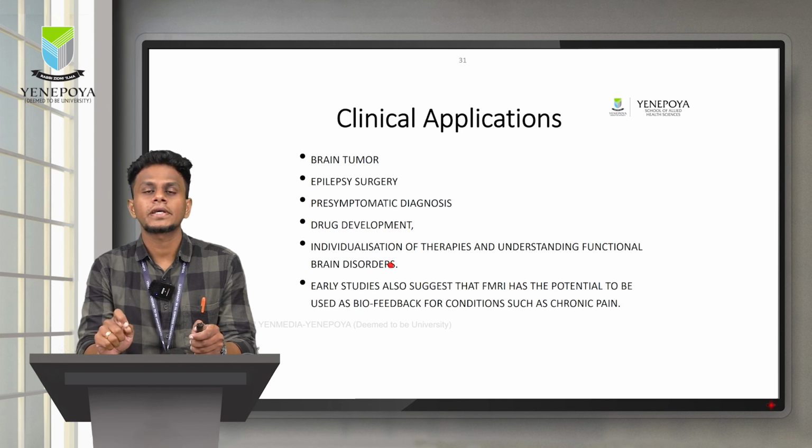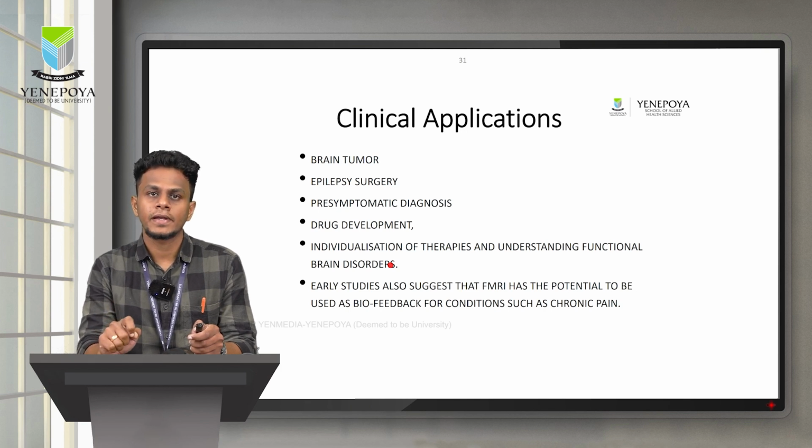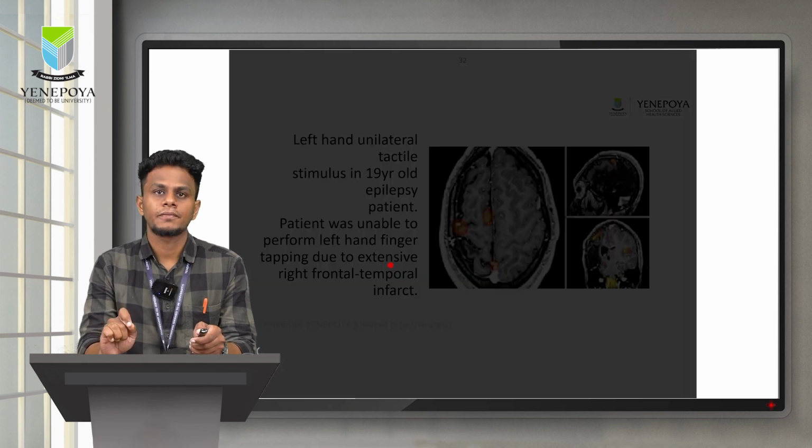And one more thing: in case of an infarct, the salvageability of a tissue and the corresponding activity in that particular area can also be determined by fMRI, so that the treatment is going to be very efficient in such cases.